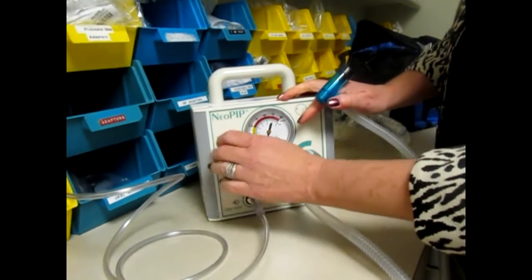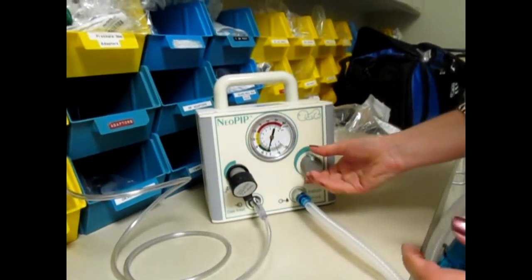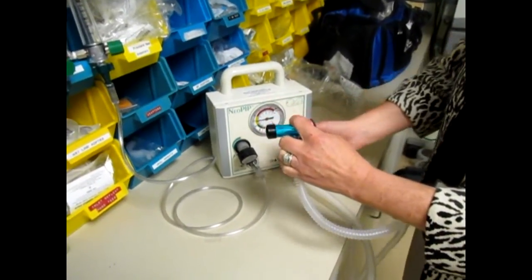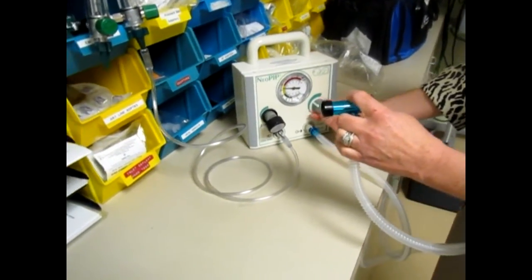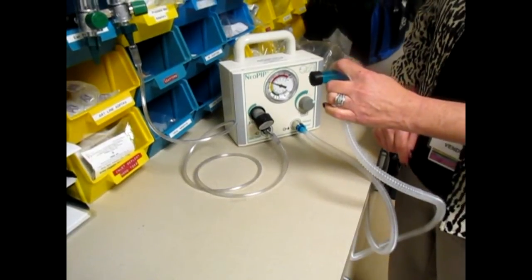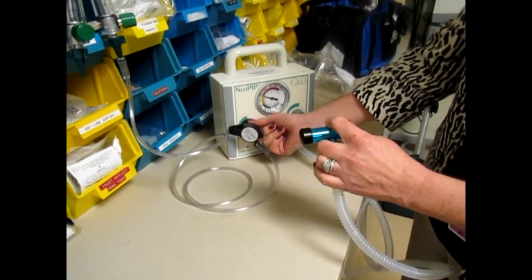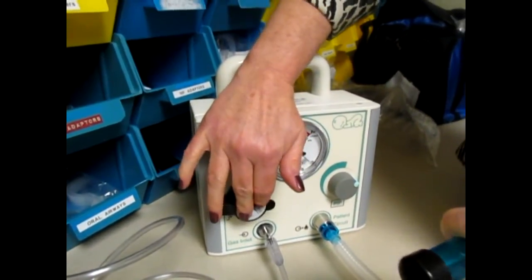What I'm teaching the nurses to do first off is to make sure they know where their pop off is. This is the pop off. You want to occlude the CPAP nozzle and keep the patient inlet occluded with the black cap that comes with the circuit. Turn up your PIP knob clockwise all the way until it stops. This is stopping at about 40, so that is where the safe pop off is set.